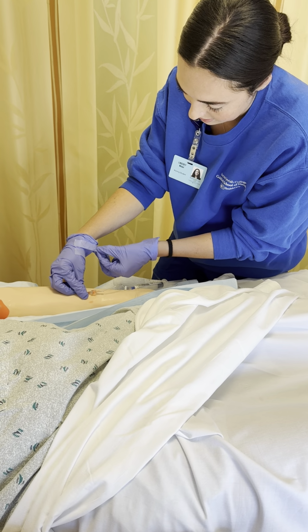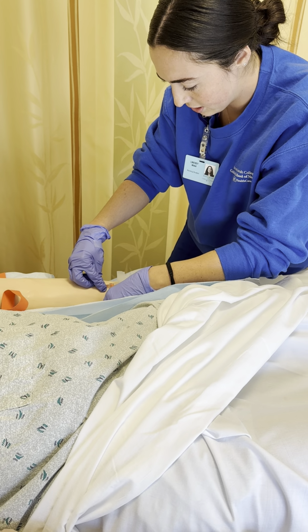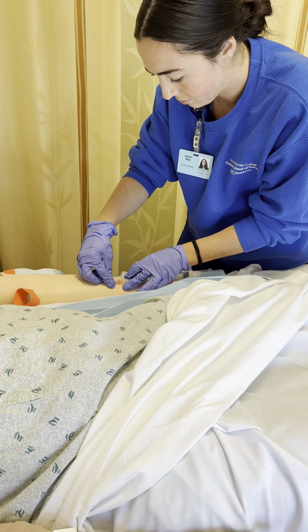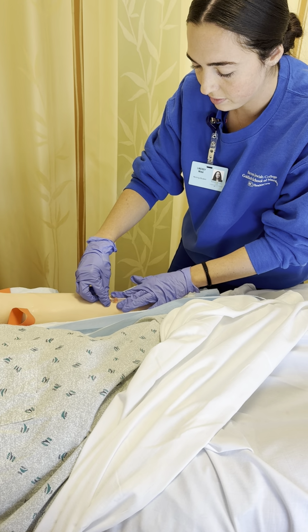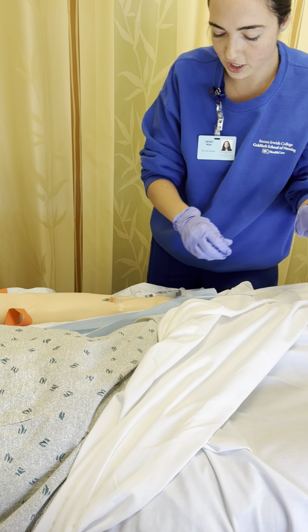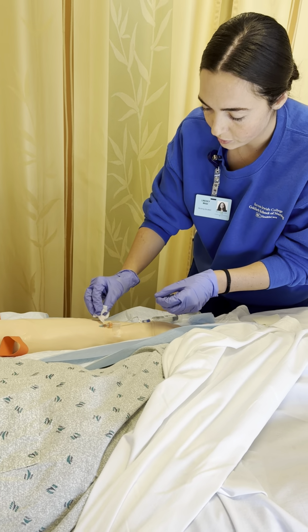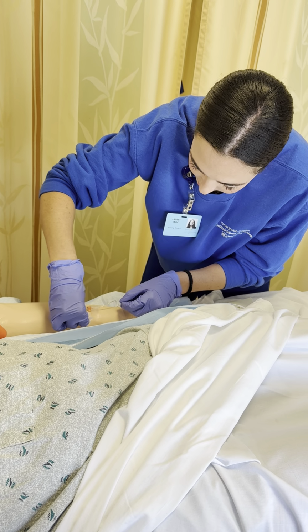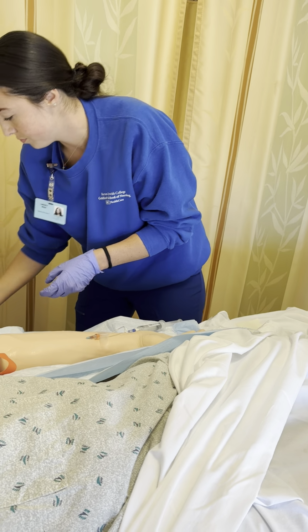I'm going to take this piece of tape and place it on the edge. Okay, so I've got the tape on there to secure it. Dry up any excess area and make sure not to touch the catheter.